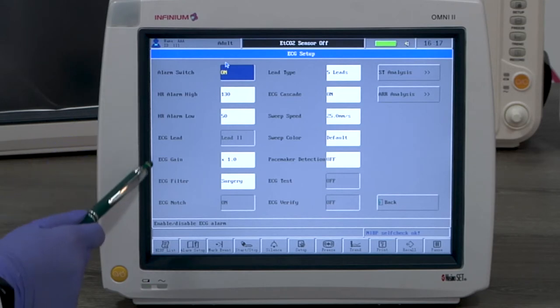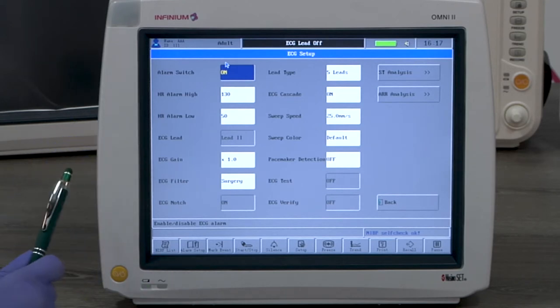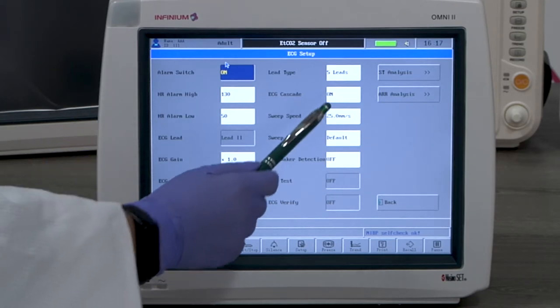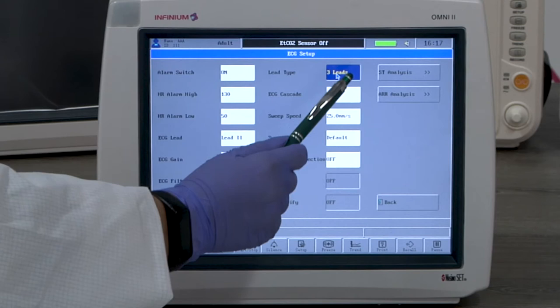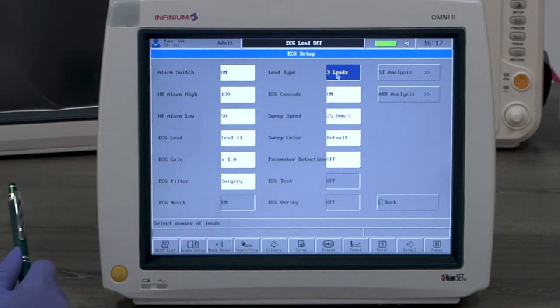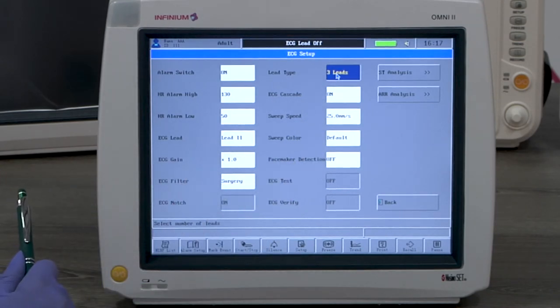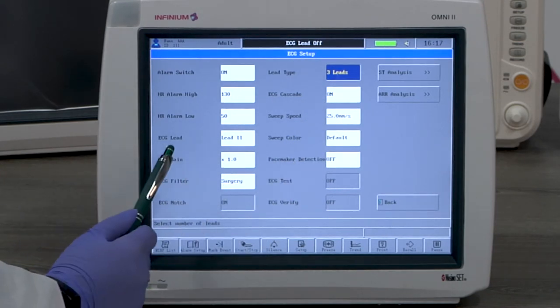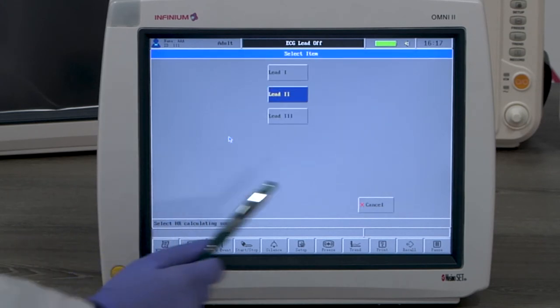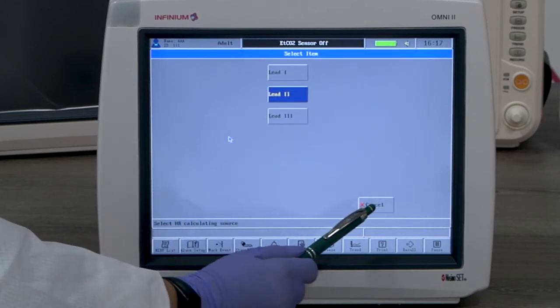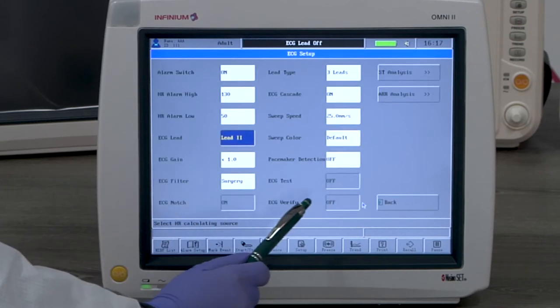The lead type option allows you to choose the ECG to be either 5 lead or 3 lead. When 3 lead is selected, the ECG lead option will be available for selection. Only the selected lead will be displayed.